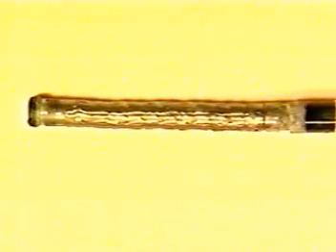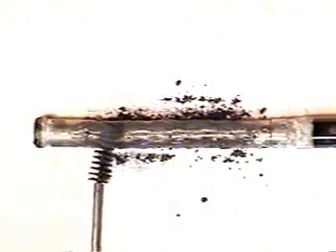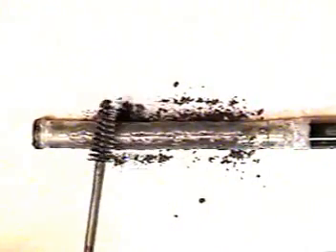We will now prepare the bending section. It is not always necessary, but you can apply a thin coating of molybdenum powder, which is a graphite powder, to the bending section, which allows for less friction against the bending rubber sheath. Again, this is a molybdenum graphite powder.